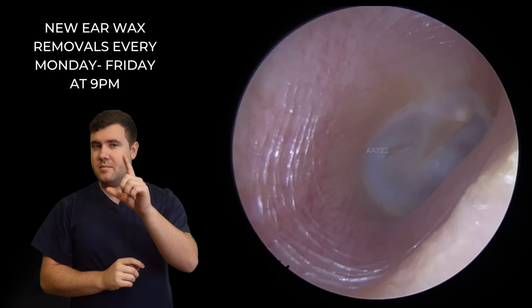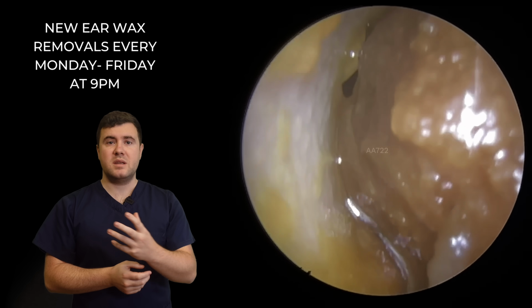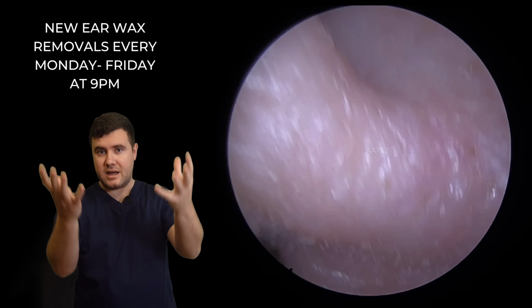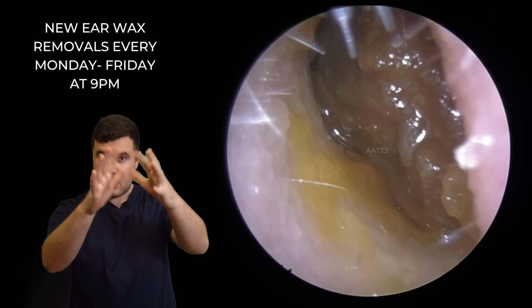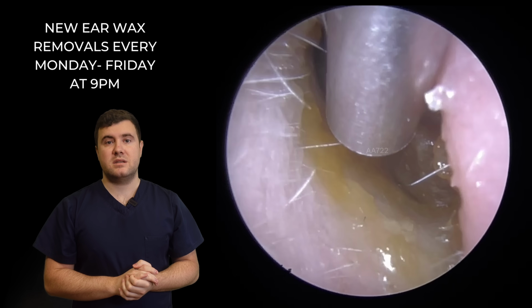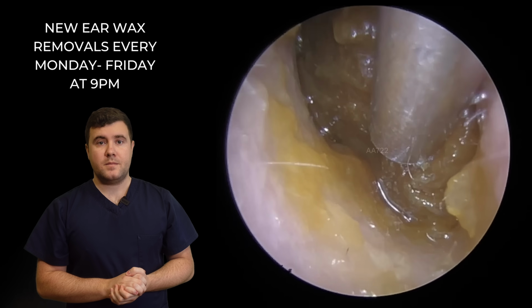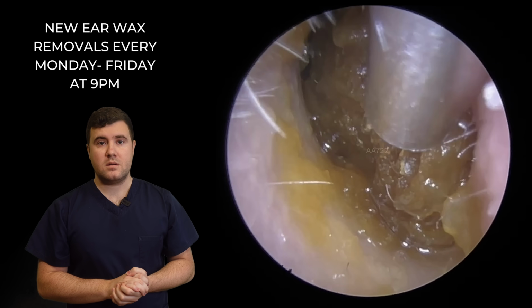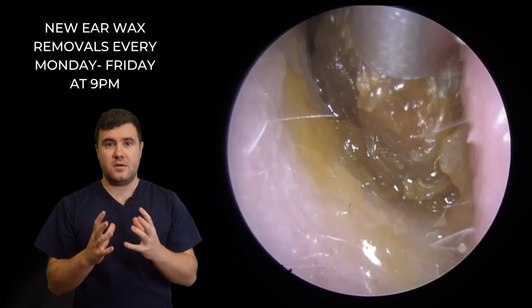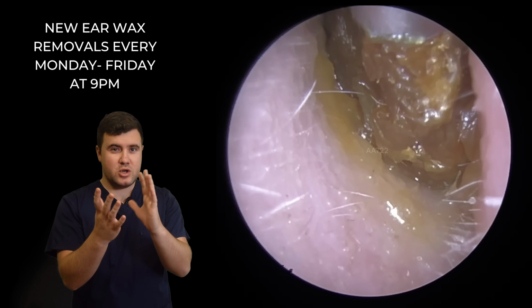So this is the same patient here now, but obviously the other ear. Very similar story here. Patient's been using oil. That's what all that kind of sheen and that kind of wet look around the outside of the wax. Sticking with the standard size Zollner tube here. Same job here. We're just going to try and walk this out, this plug of wax. Little wiggles side to side, try and sort of shimmy this out.